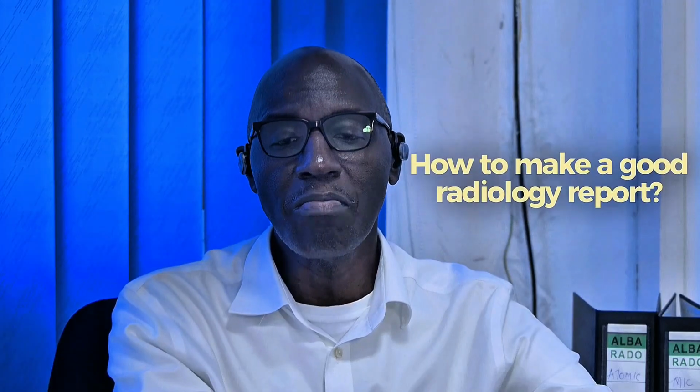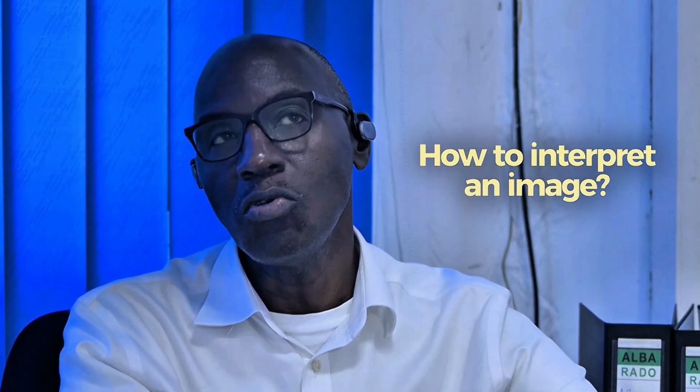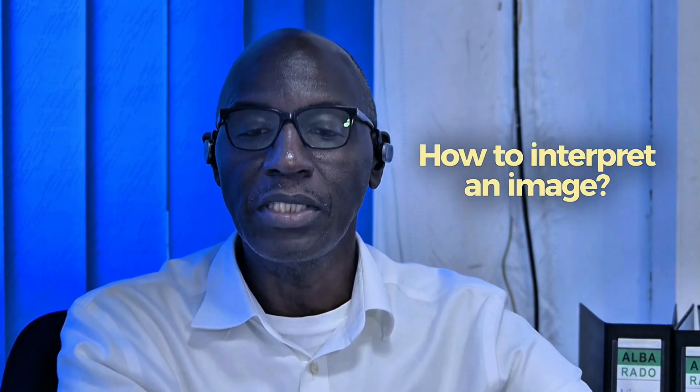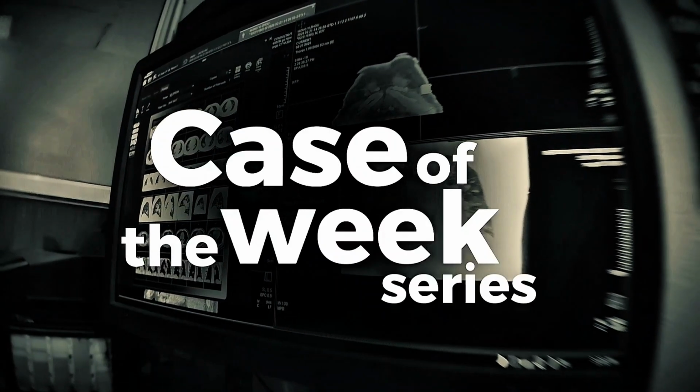I will start by reminding us how to make a good radiology report. How do you go about interpreting an image? Again, I will start by reminding us how to make a good radiology report.